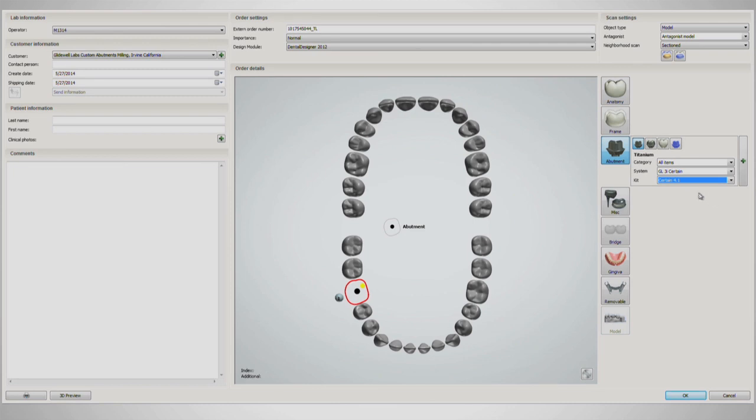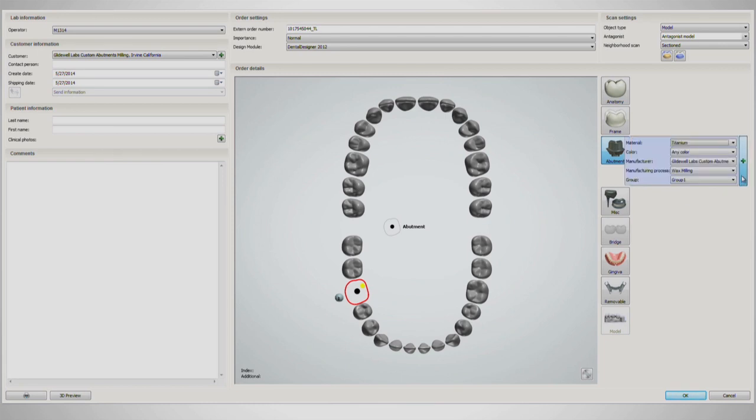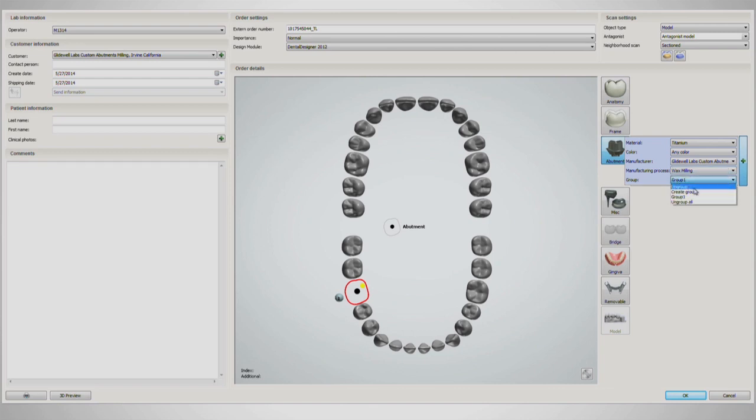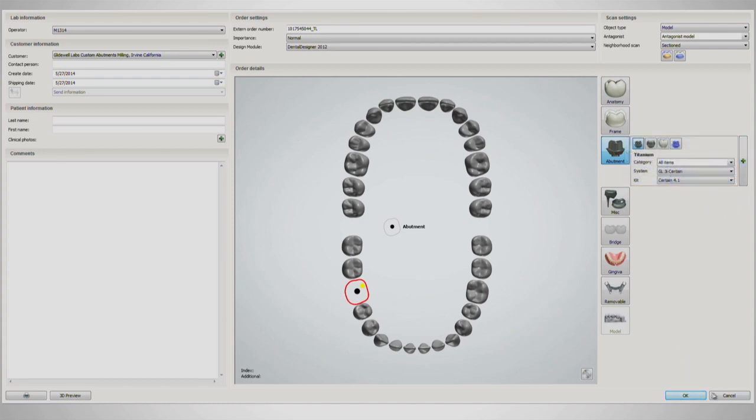Once satisfied with the selections, it is important to check the auto-filled information by clicking the green plus sign menu to the right. Under the Group drop-down, be sure to select Ungroup, as grouping is only used for bridges. Click OK on the bottom right of the screen to continue.